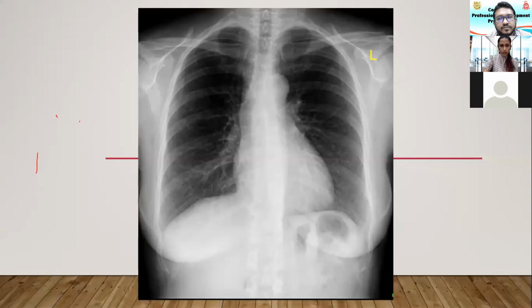Third question: how to check for cardiomegaly in an AP view? Yeah. So the basic way of doing it: you can't do it in an AP view. In AP views, you will have apparent cardiomegaly because the heart is away from the X-ray film. So you can't describe cardiomegaly in an AP view. But in a PA view, it's the intrathoracic distance. You get the widest diameter of the heart, but it doesn't have to be at the same level.